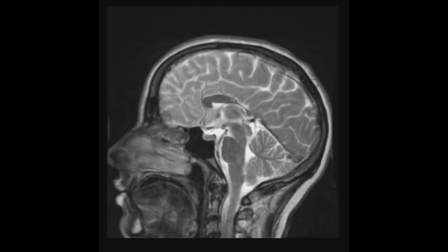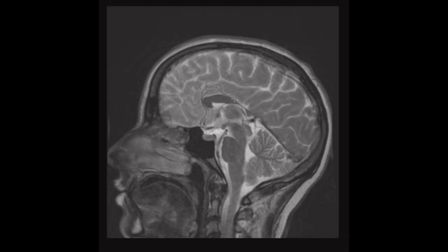Now going back to our patient — a small corpus callosum. We call this partial absence of the corpus callosum. Now we're going to look at the pituitary gland. When we see this finding, we look for other midline anomalies. Sometimes patients will have a small pituitary gland, but this patient has a normal size pituitary gland.